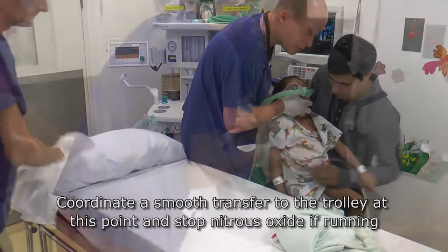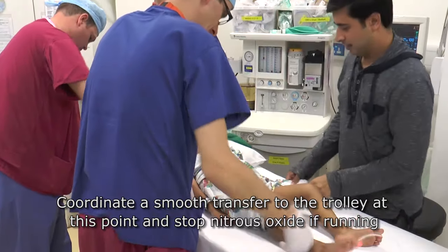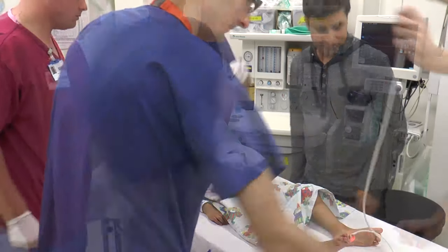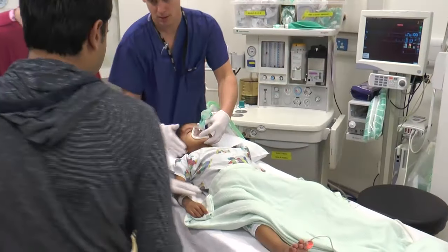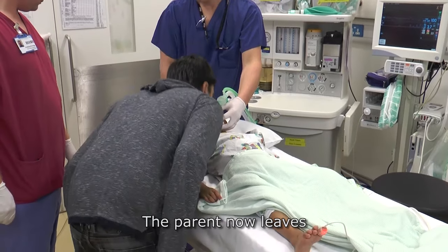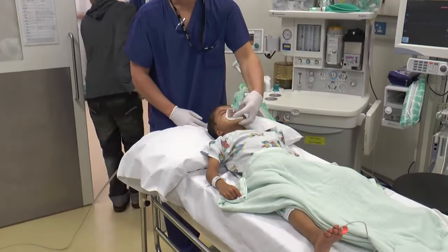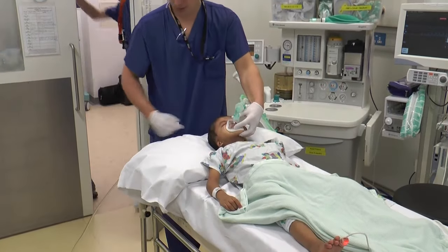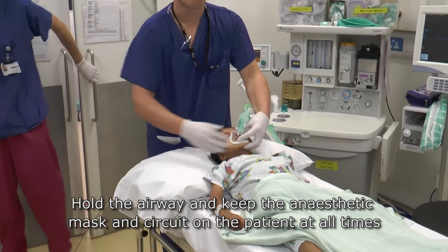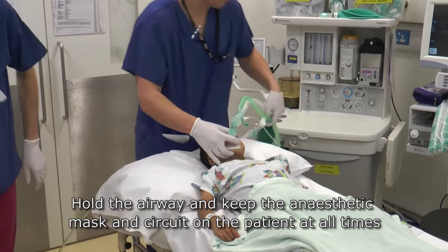Coordinate a smooth transfer to the trolley at this point and stop nitrous oxide if running. The parent now leaves. Hold the airway and keep the anaesthetic mask and circuit on the patient at all times.